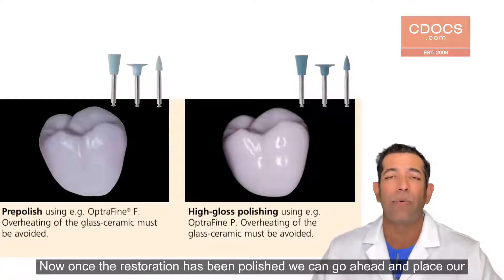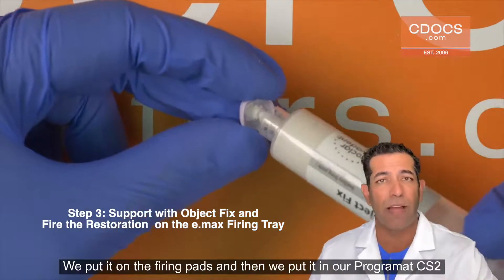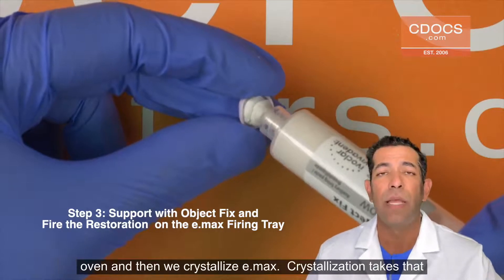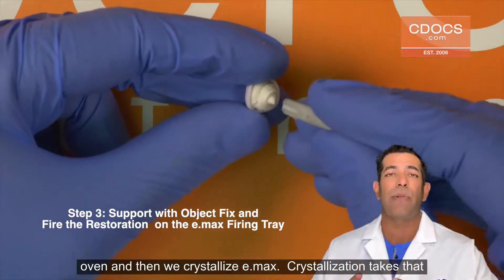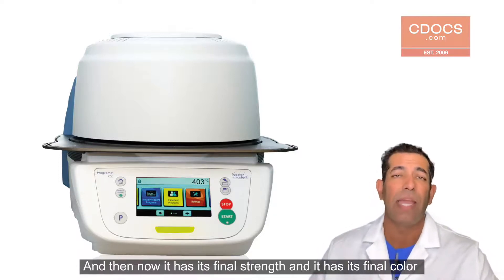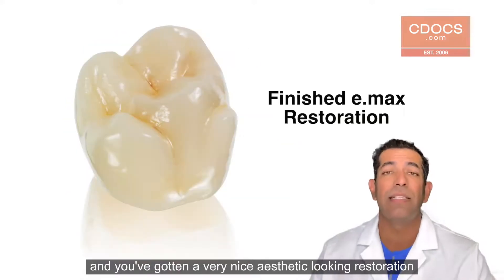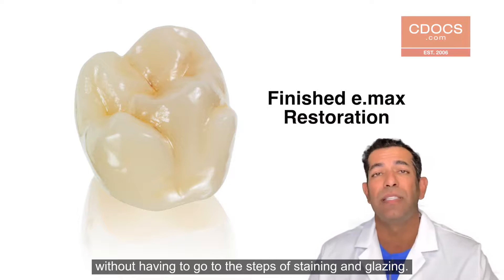Now, once the restoration has been polished, we can go ahead and place our object fix on the restoration. We put it on the firing pad and then we put it in our program at CS2 oven and then we crystallize eMax. Crystallization takes that restoration and makes it into the lithium disilicate material, and now it has its final strength. It also has its final color and you've gotten a very nice aesthetic looking restoration without having to go through the steps of staining and glazing.